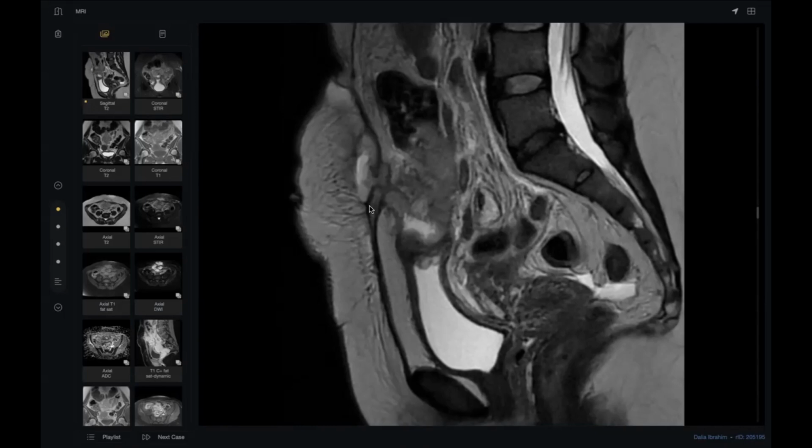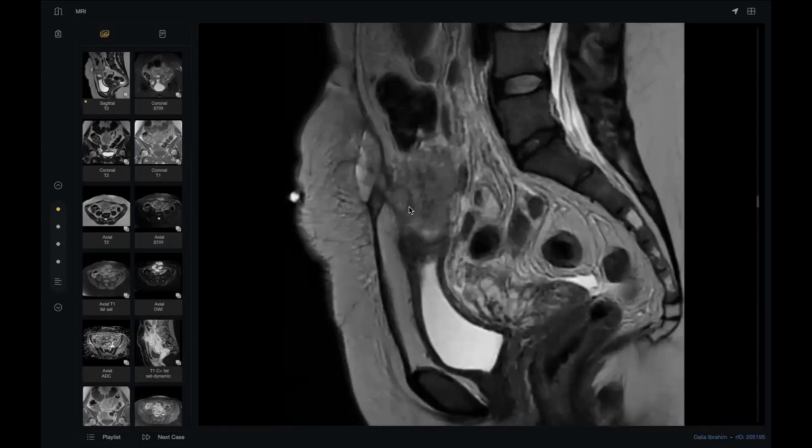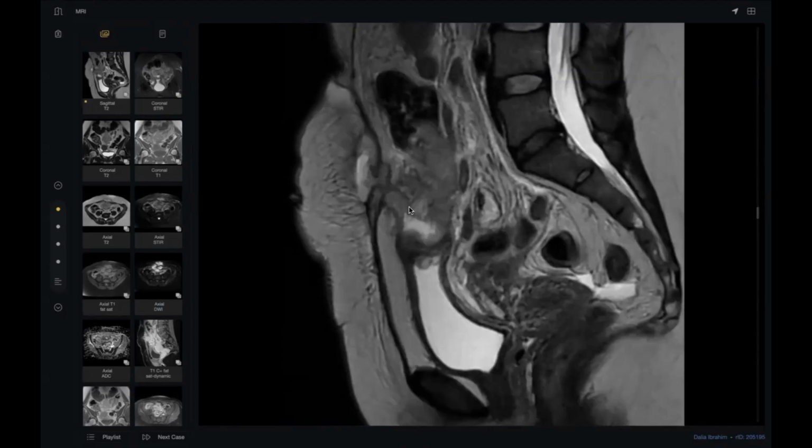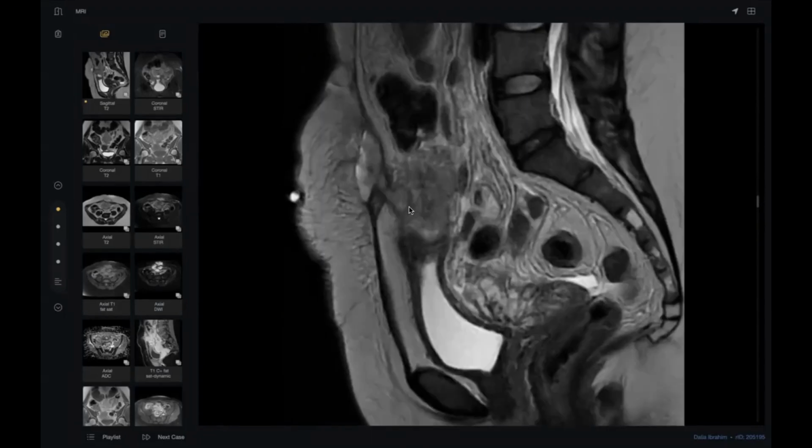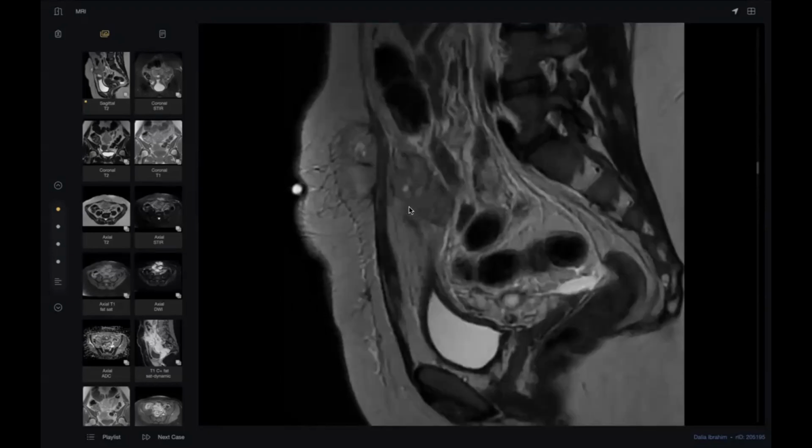This is an aggressive lesion in the dome of the bladder extending to the umbilicus, but it has a collection inside. Number one, it may be an urachal carcinoma. Number two, maybe sarcoma, no problem. Number three, it may be infection due to the laparoscopic instrumentation. And by the way, this is an infection, actinomycosis. Okay, actinomycosis. But see, doctor, you are right. You are correct. Many cases in viva are cases for differential diagnosis.